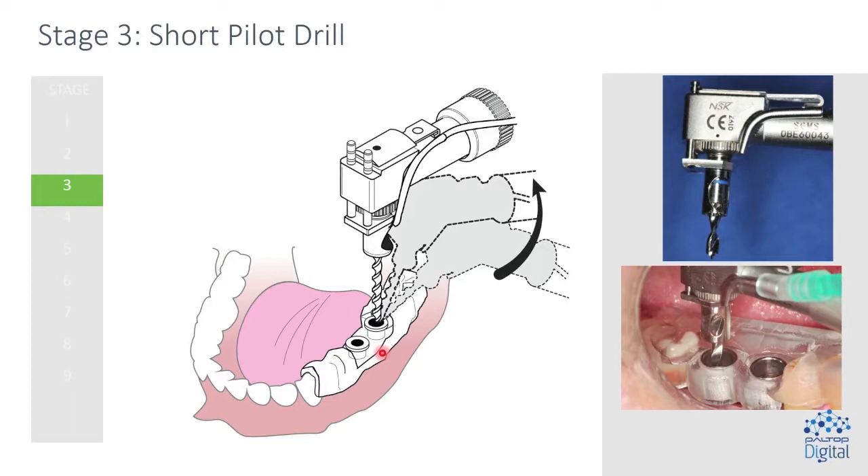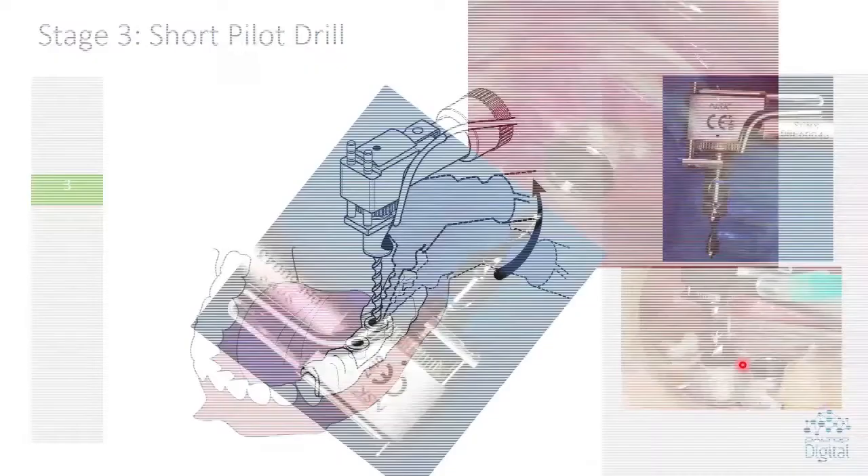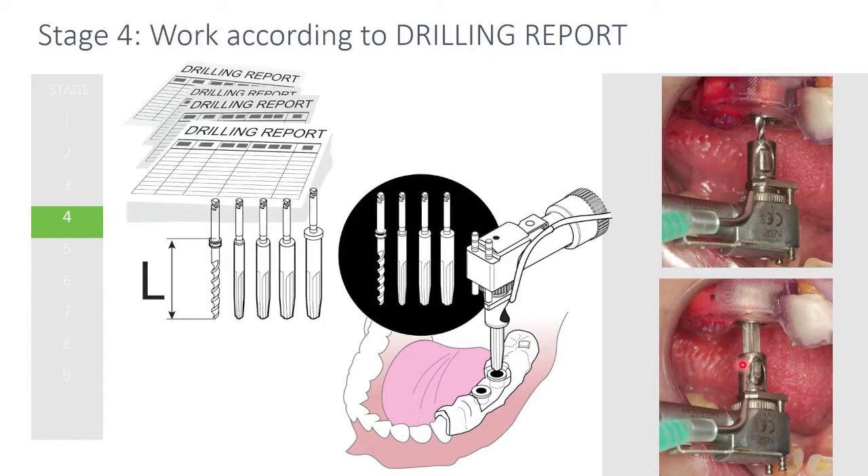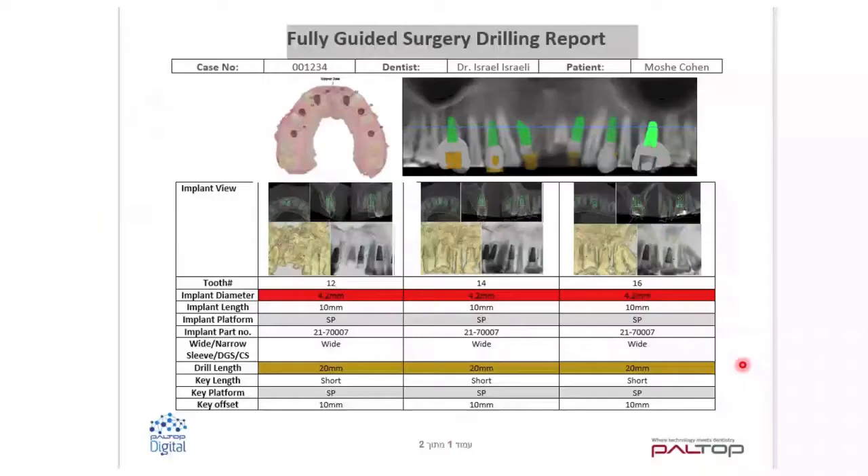Now I put in what's called the short pilot drill. You'll see that the drill sticks out, so when this drill enters that sleeve there's no guidance. I kind of know where it is because I'm going to put it about the center of that sleeve. I don't have guidance until the DGS itself engages the sleeve. So I have to have a drill short enough that the sleeve goes into the DGS — into the drill guide sleeve — before the drill touches bone. So I first put in the short pilot drill and it will create a hole two to three millimeters into bone as a starting point. Once I've done that, I can come back with my subsequent drills and they'll fall into that initial hole and get guidance from the sleeve.